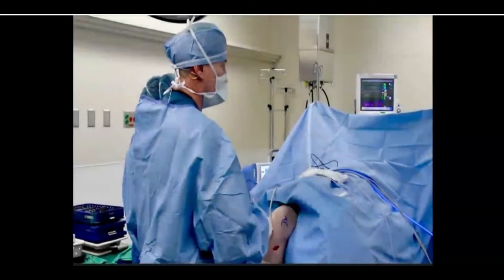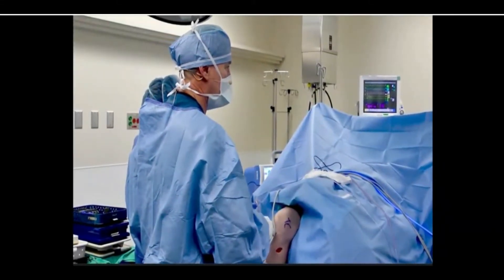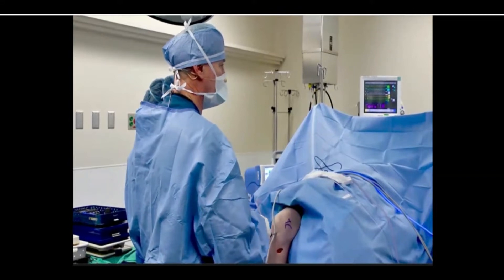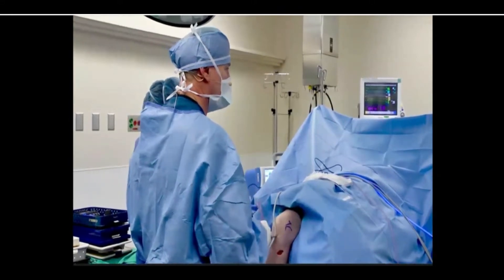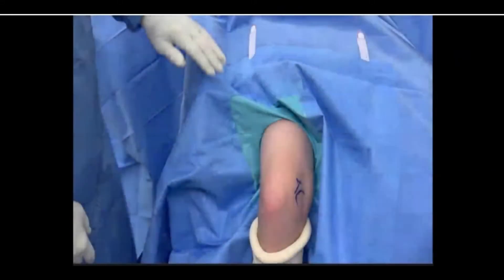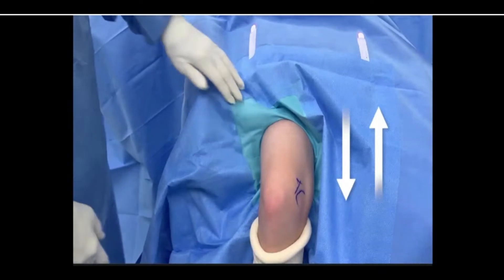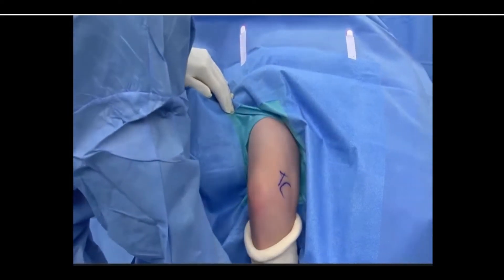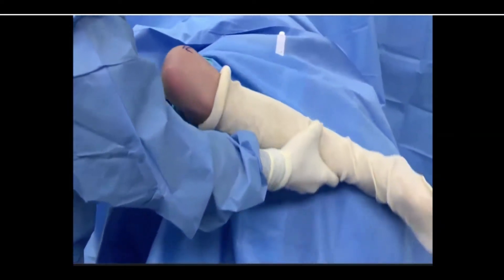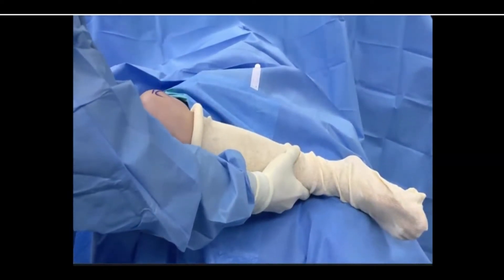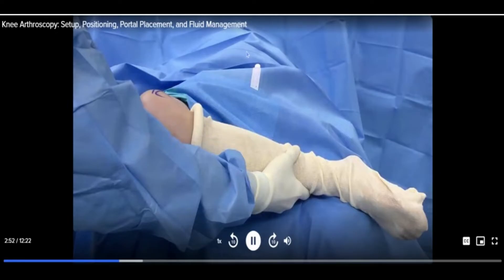Knee arthroscopy is typically performed with the patient in a supine position and the surgical team either at the foot of the bed or on the operative side. The patient should be positioned such that the foot of the bed can be lowered or raised without risking patient safety or injury. Be sure the patient is in a position that allows the proper range of motion — for example, hyperflexion of the knee or significant external rotation of the hip needed to complete the procedure.